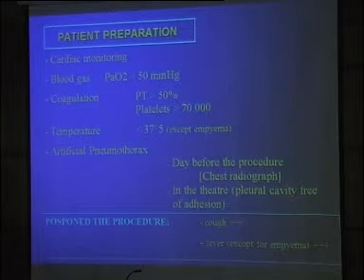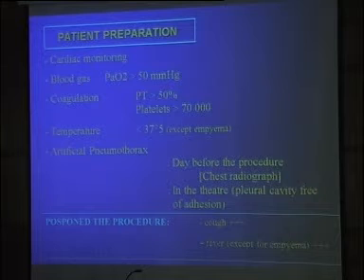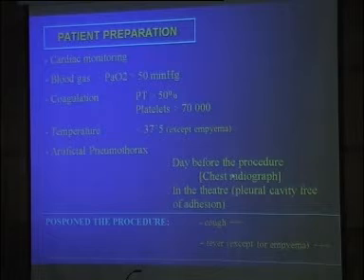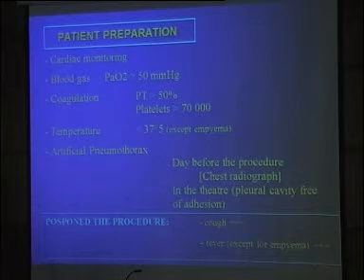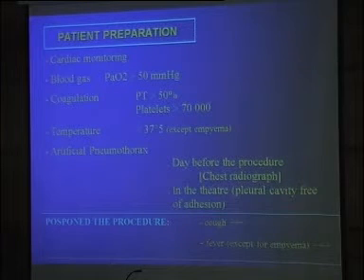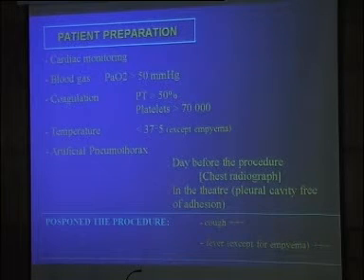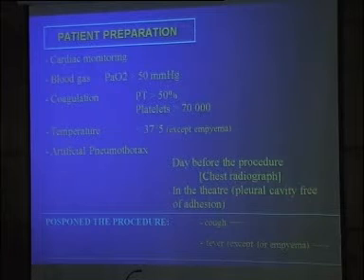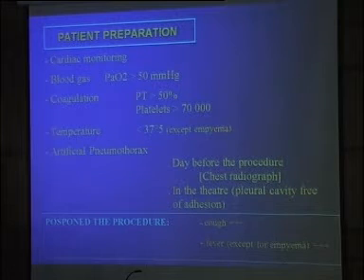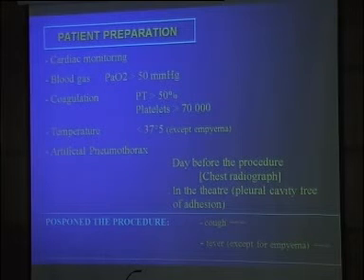Of course, if the indication of the thoracoscopy procedure is MPM, we perform the procedure, and we try to perform the artificial pneumothorax in the theater when there is pleural effusion, and we think that the pleural cavity is free of adhesions. But if we have a suspicion of loculated pleural effusion or something like that, you can try to perform the artificial pneumothorax the day before the procedure. My young colleagues, because I'm of the old generation, use ultrasonography to check the pleural cavity, which is very relevant, of course, but as I told them, it has costs for the procedure.